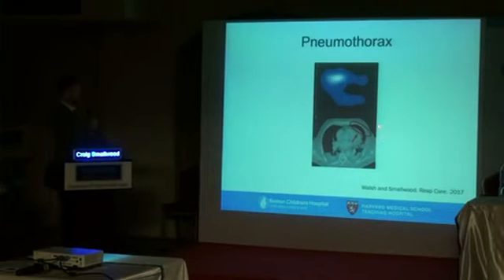But what you can see here is a radiographically identified pneumothorax in this region of the lung, and you can consequently see the absence of ventilation in that area of the lung as well. However, and this is an important caveat, you can't just look at a region that has previously had ventilation and now has no ventilation, because the EIT isn't sensitive enough at this point to tell you whether or not that is specifically a pneumothorax. What it can tell you is there's no ventilation, but then it's up to you to go down your differential and decide what has caused that decrease in ventilation.